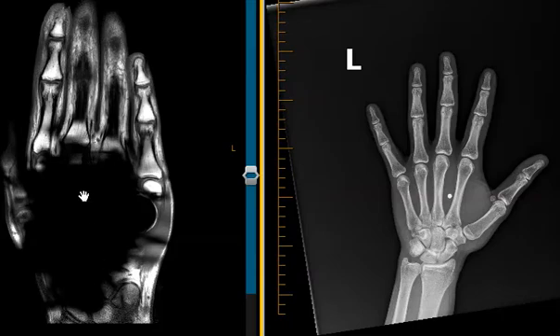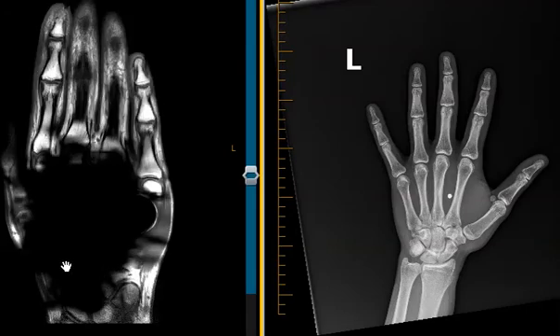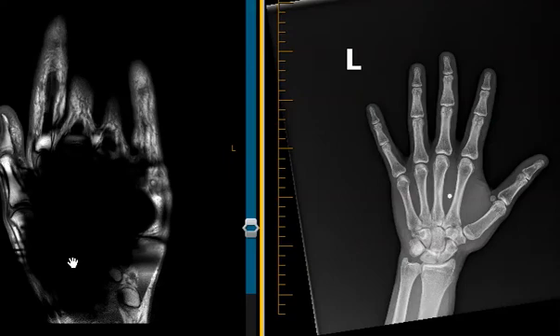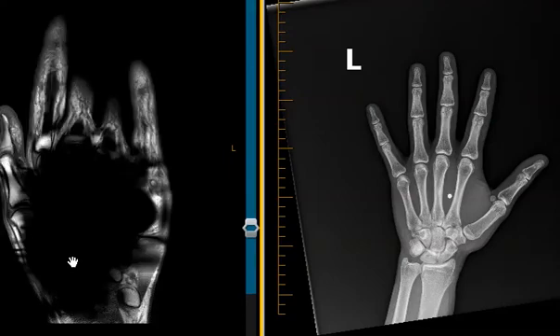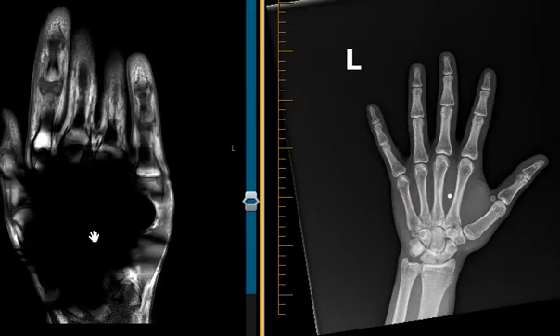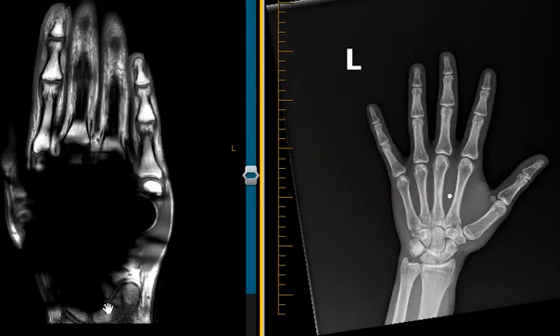MRI uses magnetic fields to create images, so when there's metal like this, it distorts the magnetic field around the BB and the images look like this — you see a big area of just darkness. Sometimes it's not as profound as this; most of the time it's not nearly as bad. But this is an example of how bad it can be just with a small piece of metal. This is called metallic susceptibility artifact, and it can be caused by small metal fragments anywhere in the body. Thank you very much.